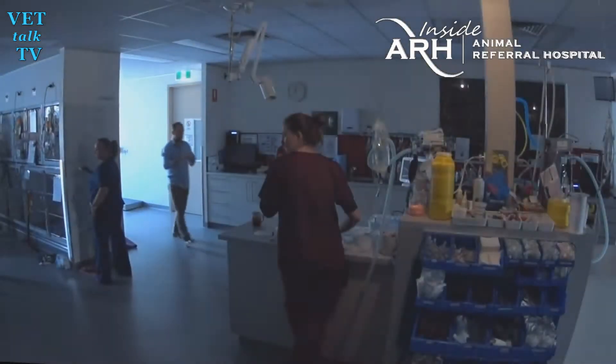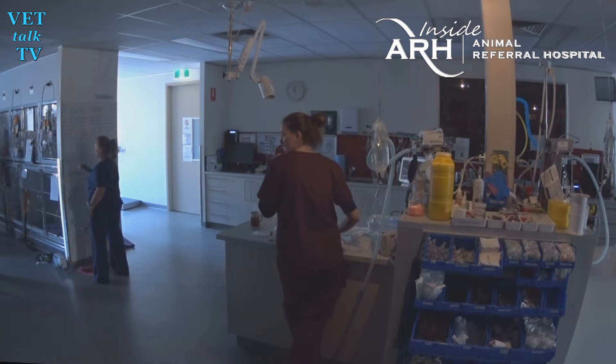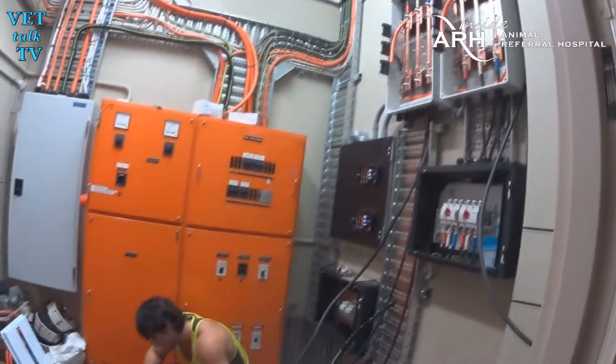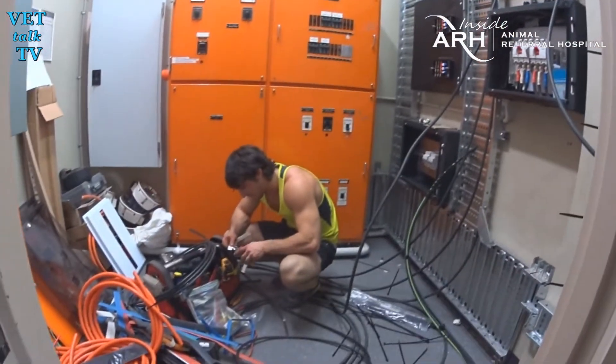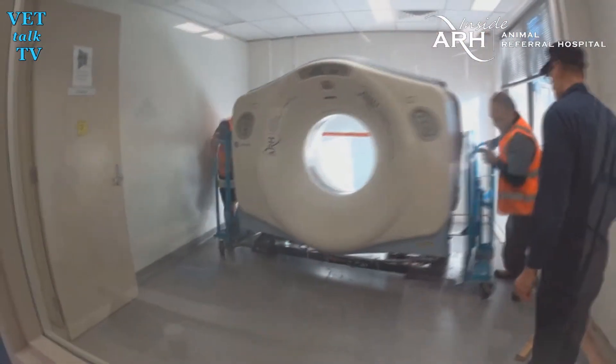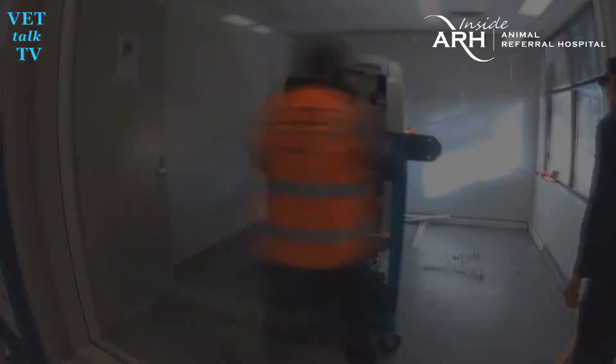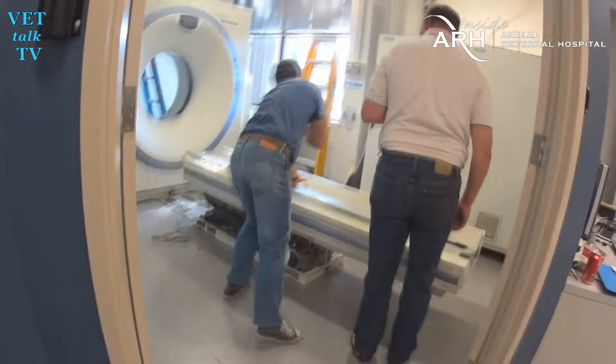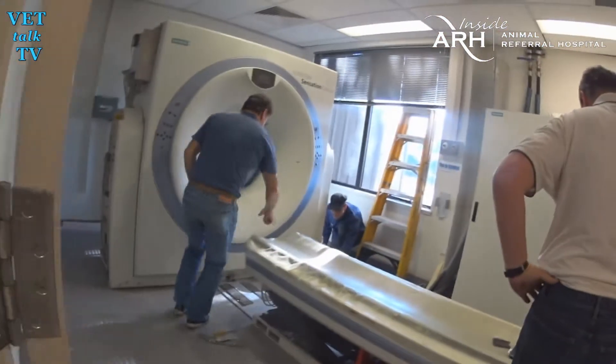Do you remember this? Blackout. The lights went out. It's an amazing thing. The giggles are a bit of a giveaway, but this isn't a random blackout. It's part of a carefully orchestrated plan to safely remove the old CT scanner to make way for ARH's latest and even faster CT scanner, the fabulously named Somaton Sensation 64.